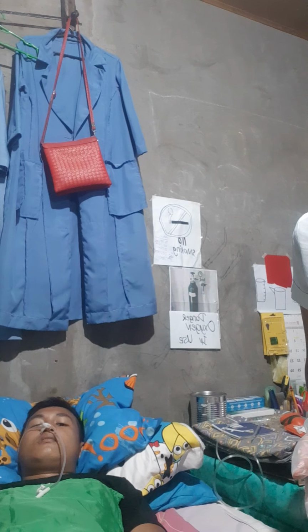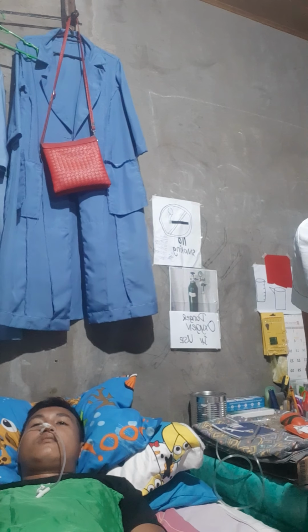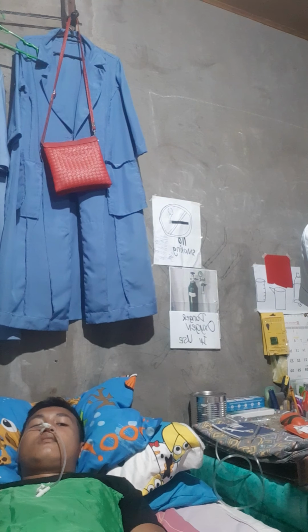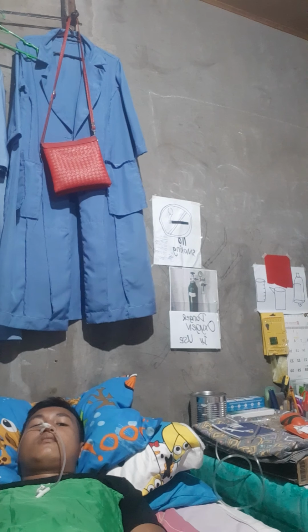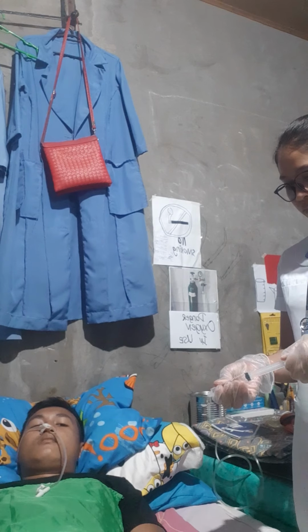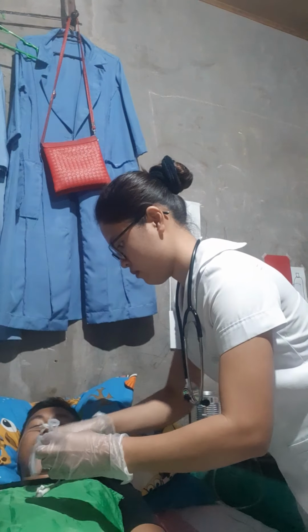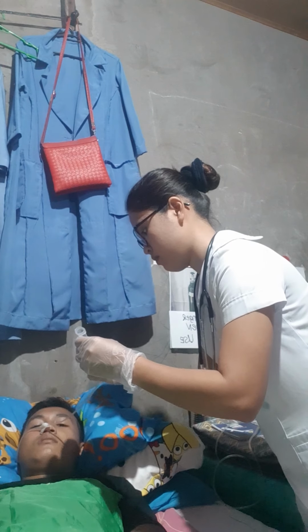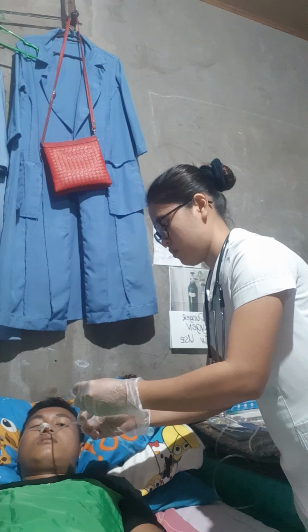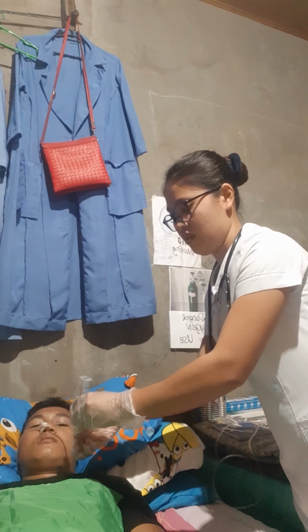Then pinch or clamp the gastric tube, because pinching or clamping the tube prevents excess air from entering the stomach and causing distension. Then we need to clamp or pinch. It should be like this. We can pinch it.